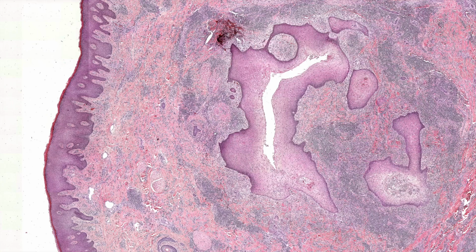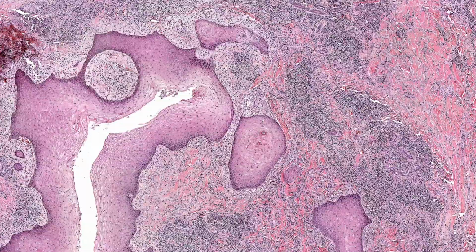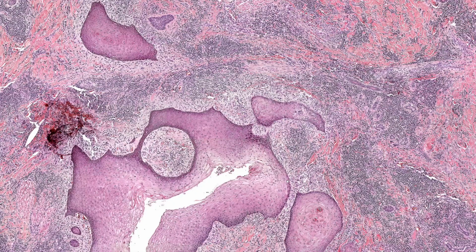So all this pattern can fit with ruptured cyst, hidradenitis, pilonidal. All of those can show an overlapping and sometimes identical mixture of features. Those features include actual cyst wall, often inflamed, often edematous and spongy, plus or minus rupture, plus or minus keratin debris, often with keratin granulomas, often with really brisk inflammation that's rich in lymphs and plasma cells. You may or may not have neutrophil abscesses.